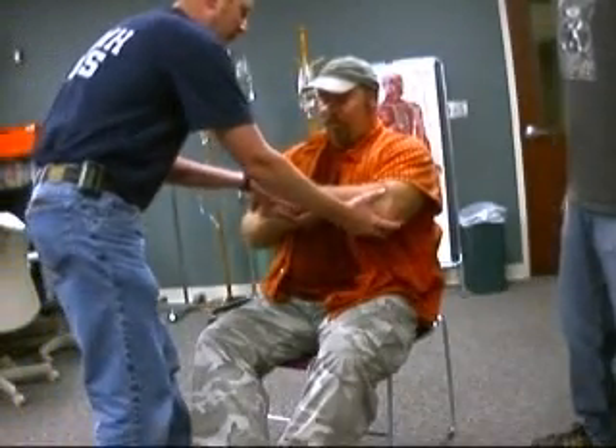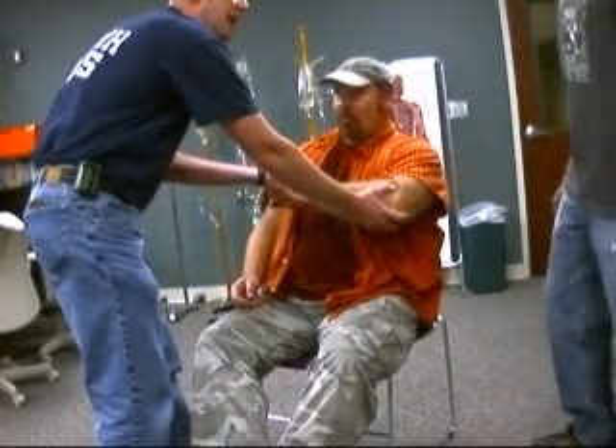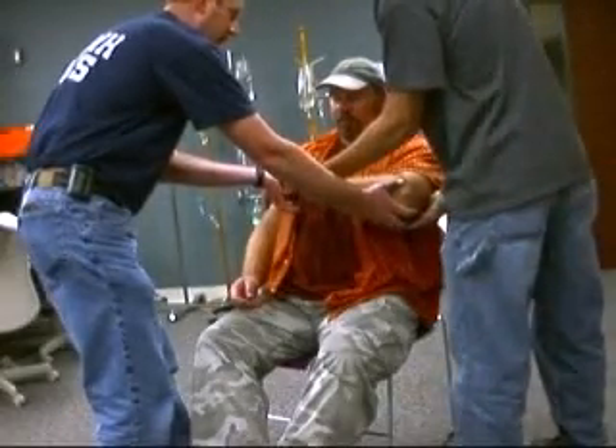I have my BSI on. Is my scene safe? Okay, I'm going to come up and take manual stabilization of the fracture site. I'm going to pass that off to my partner — go ahead and take over stabilization.